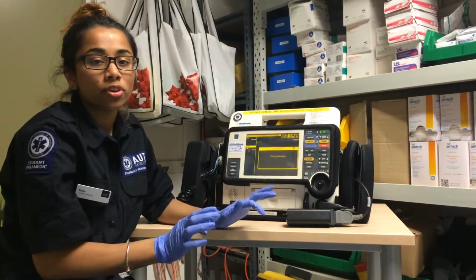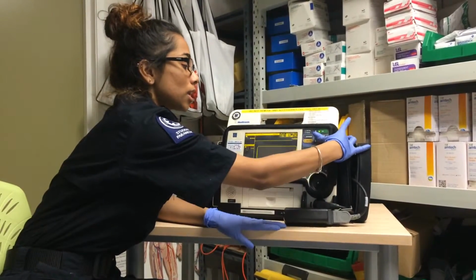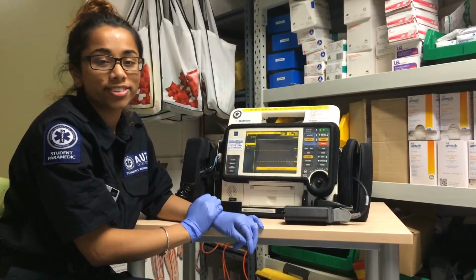So to disarm the shock, it's a similar technique. So you want to charge the machine once again. But to disarm it, you just click the select button like so, and it will disarm the charge. We're changing from manual mode to AED mode.